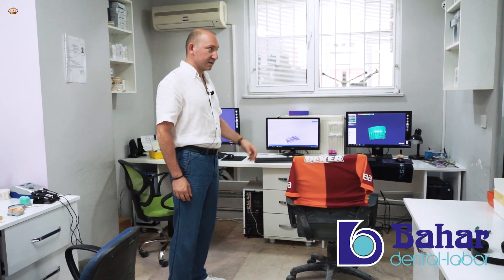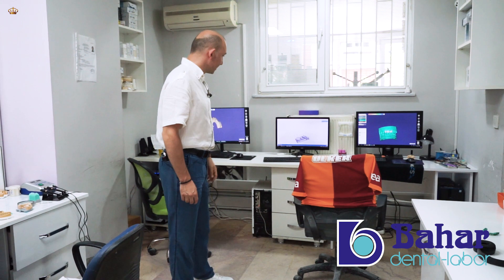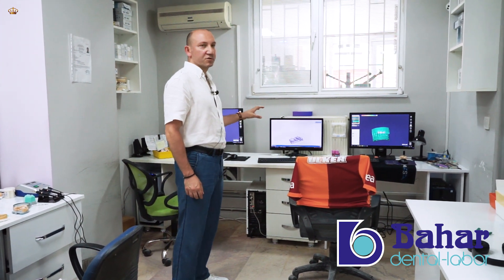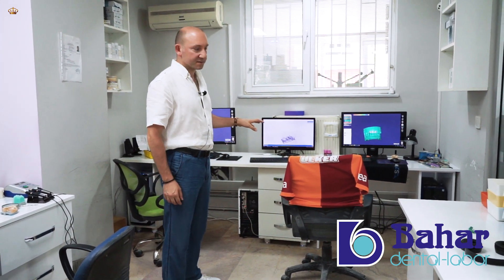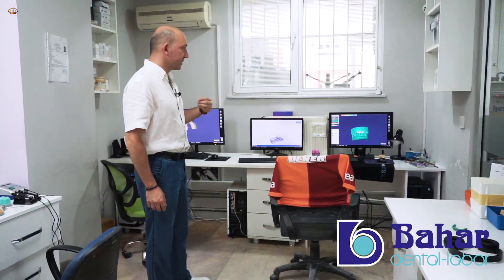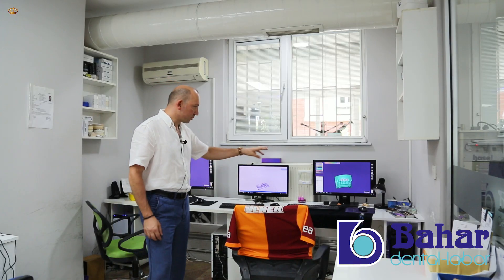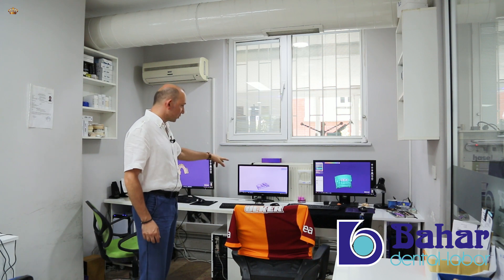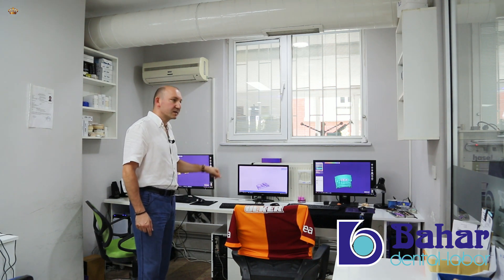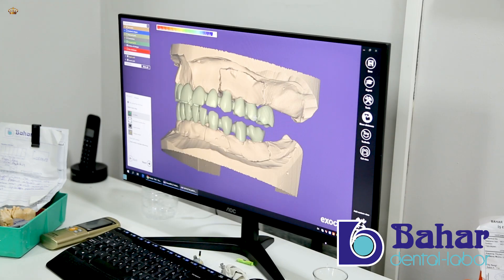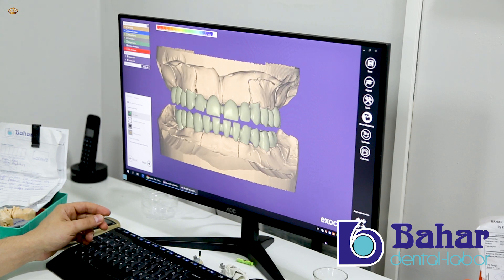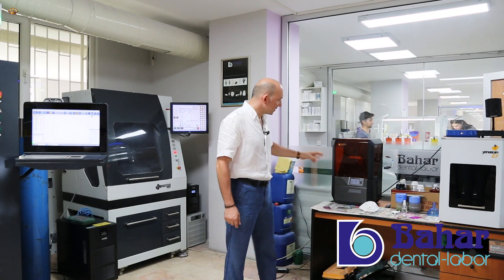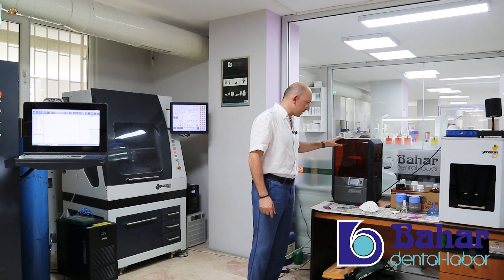Apart from the standard plaster models, we also obtain digital models. Taking as a basis the STL data obtained with intraoral scanners, we can also develop models with 3D dental design programs. We get our digital models on these 3D printers.